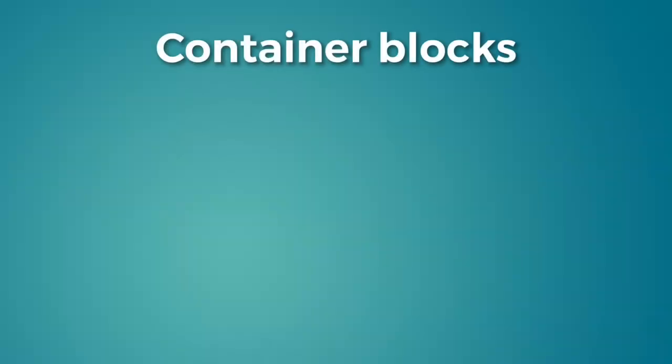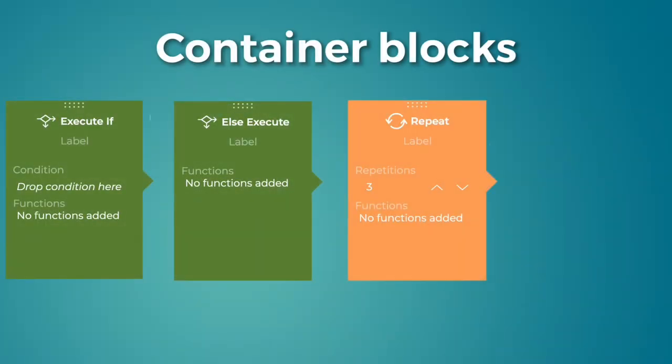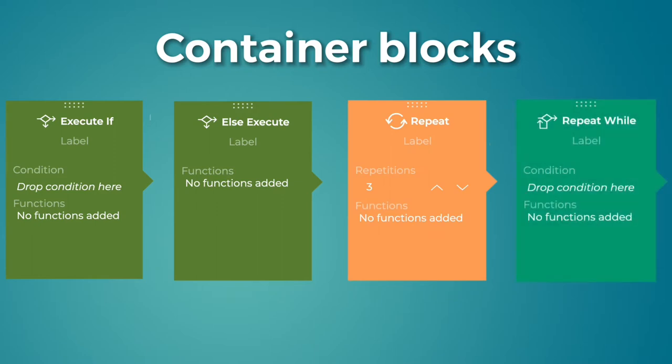These are execute if, else execute, repeat and repeat while. These blocks allow you to add conditions to a protocol which you can use to fork your protocol into different paths.